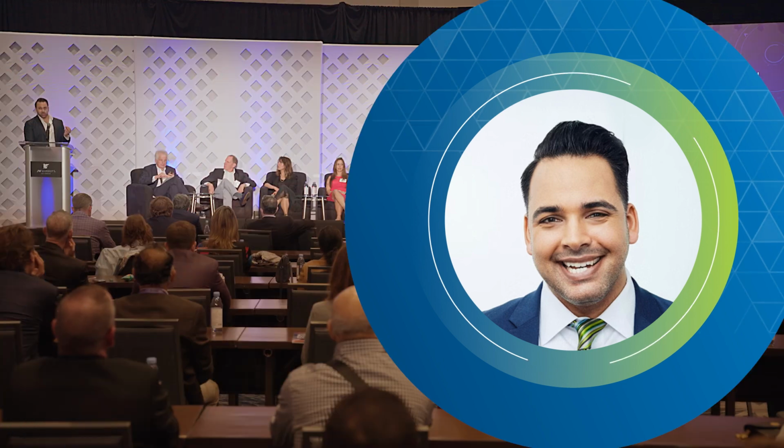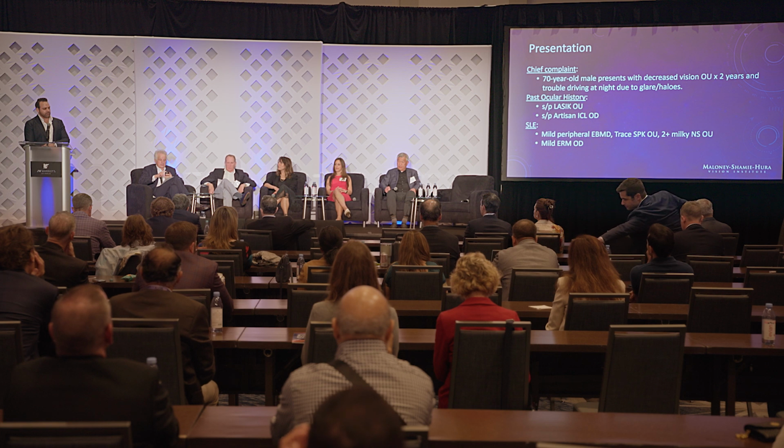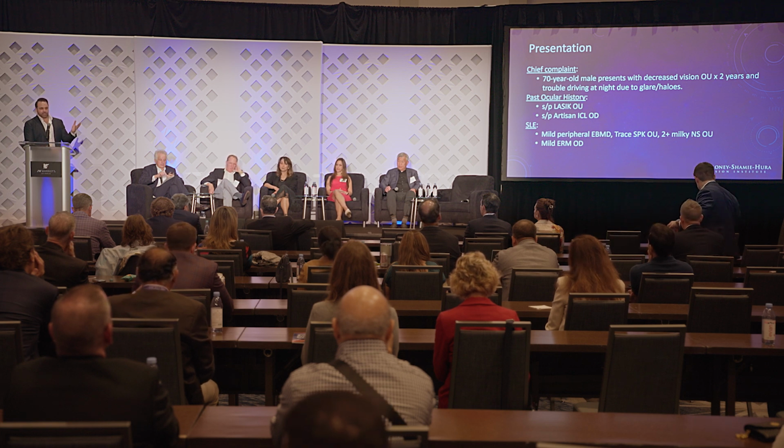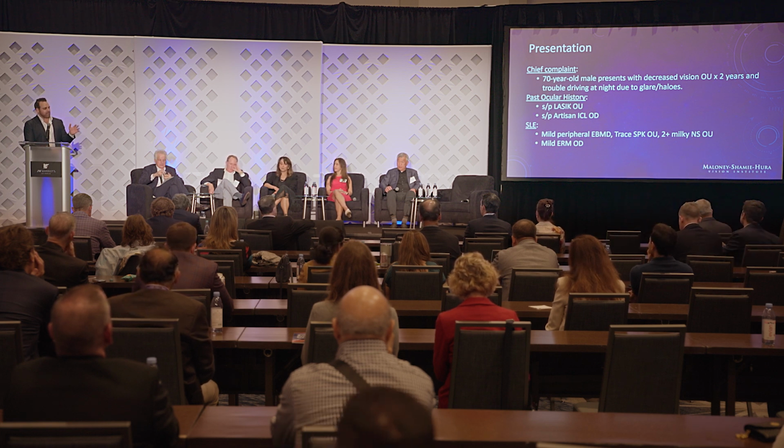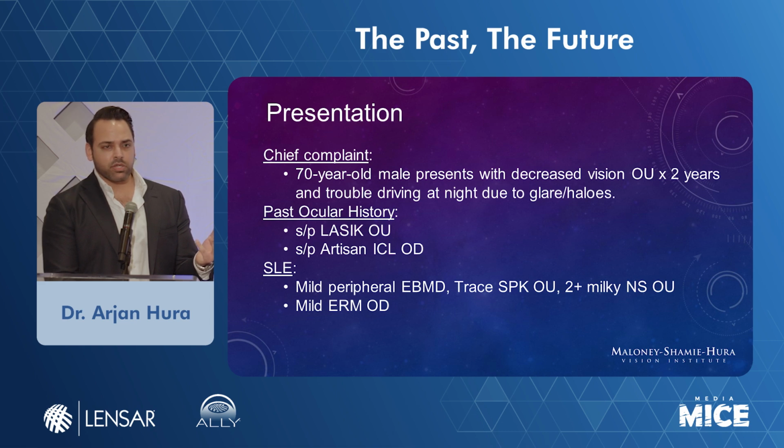This is a patient who was used to a refractive outcome previously in the past, loved his vision until the cataracts really developed. So he wanted that accuracy. When I was considering a 6 millimeter scleral tunnel, where it looked like it had been done sort of before, he had a lot of vascular ingrowth and he was developing a little scleromalacia as well. So I wasn't really sure where that previous scleral tunnel had gone through. I didn't want to intersect it, and he's a high myope. I really didn't want to run into issues with his sclera.